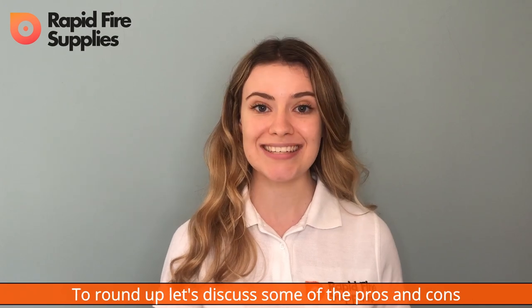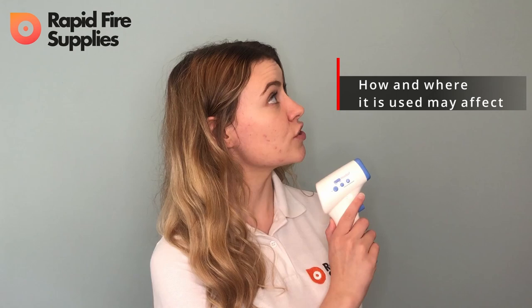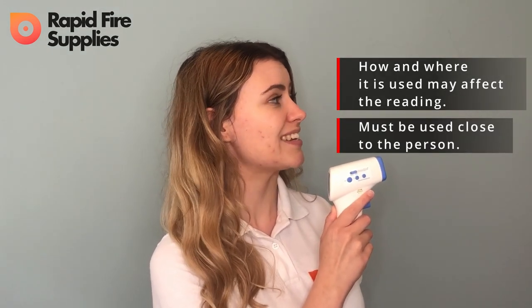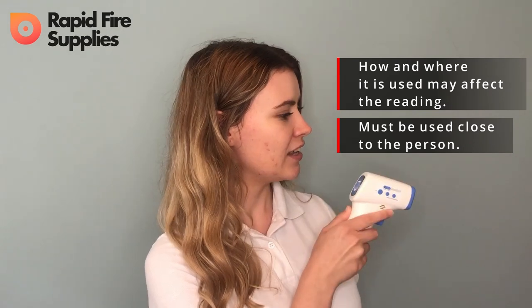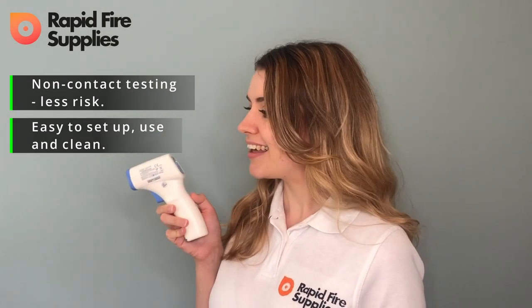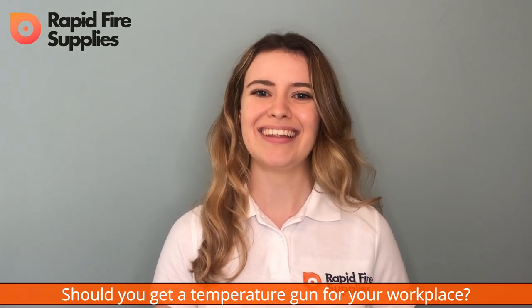To round up, let's discuss some of the pros and cons of temperature guns. How and where it is used may affect the reading. The temperature gun must be used very close to the person it is scanning. The temperature gun cannot tell you if you have COVID-19. Non-contact testing means there's less risk of spreading COVID-19. The gun is really easy to set up, use, and to clean, and it displays a reading within seconds. Should you get a temperature gun for your workplace? I'll let you decide.